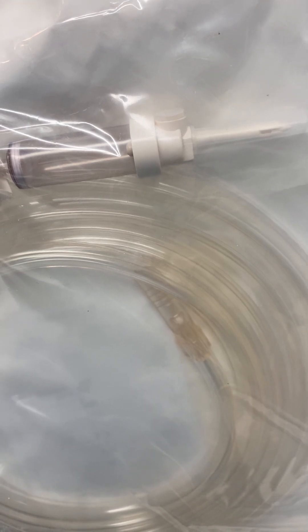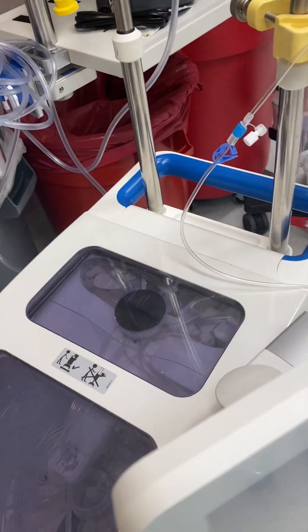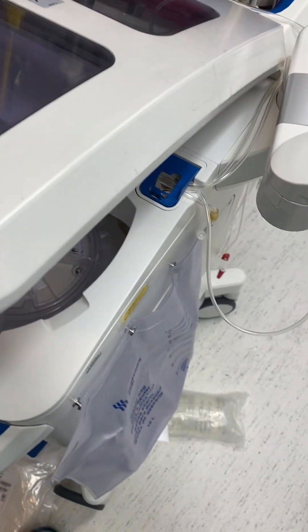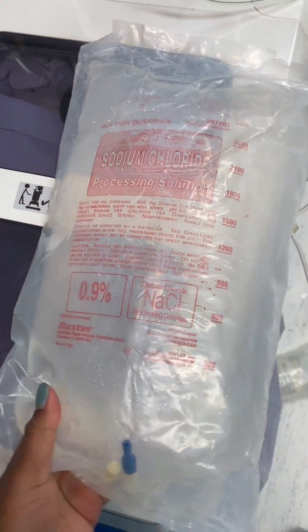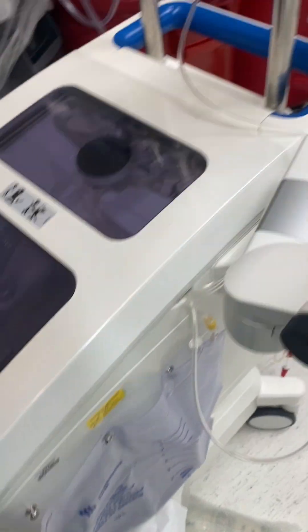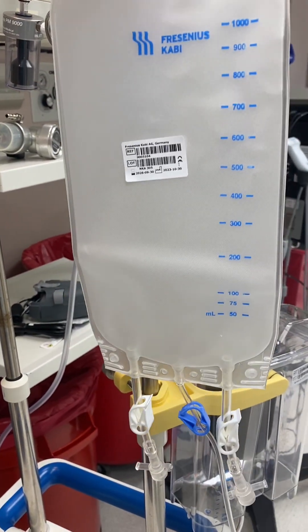This end with the spike will be attached to a heparinized saline solution. It will be sucked back and then collected, spun down, and washed with a sodium chloride solution. The waste will go in this bag, and the blood will be emptied into this bag, which will then be re-infused into the patient.